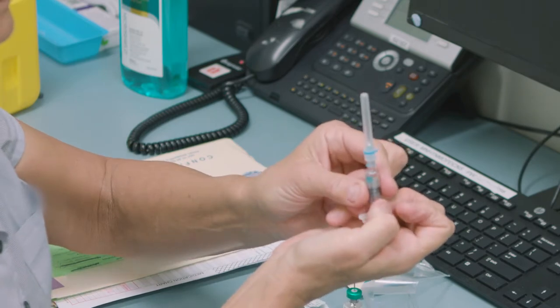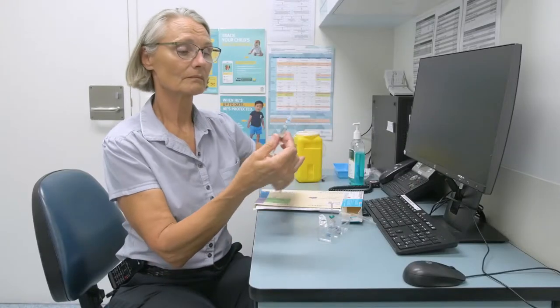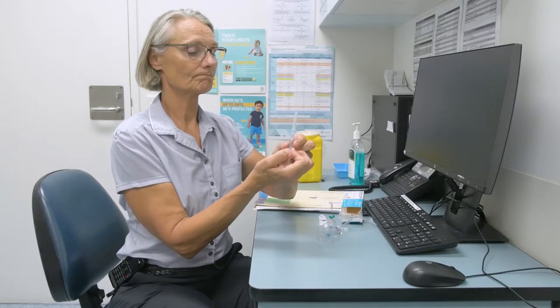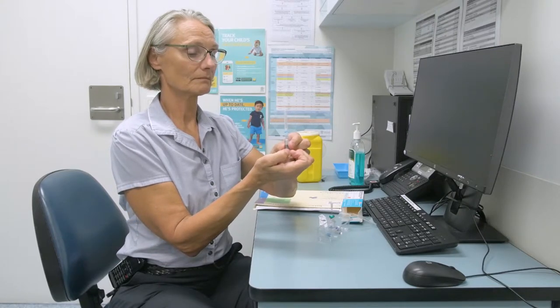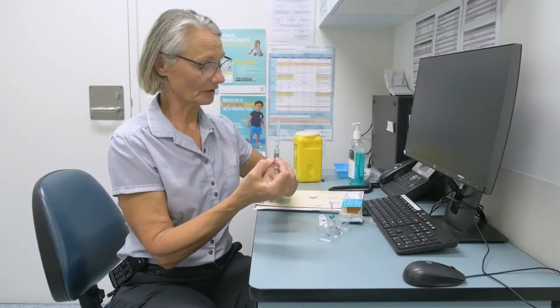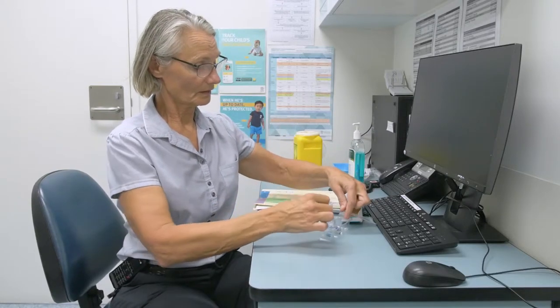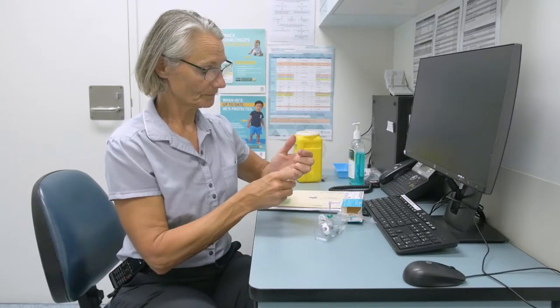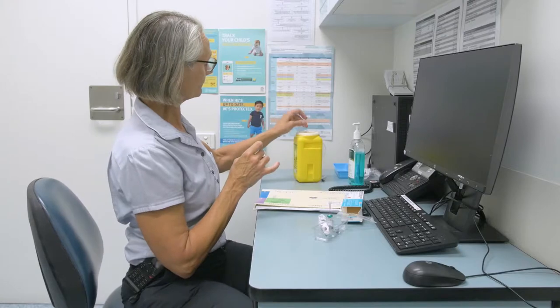After drawing up, make sure there's no particulate matter or colour change in the vaccine. The recommended dose should always be drawn up and given, regardless of the amount contained within the vial. When pre-filled syringes aren't supplied with needles, the needles should be attached just before administration.